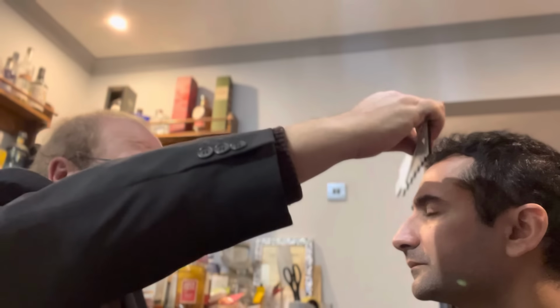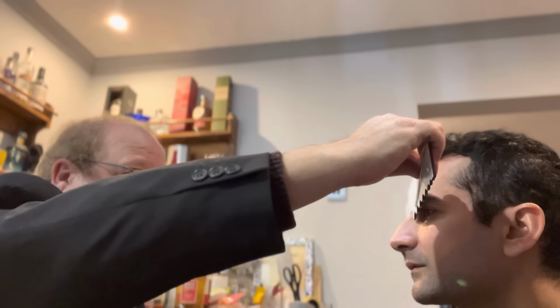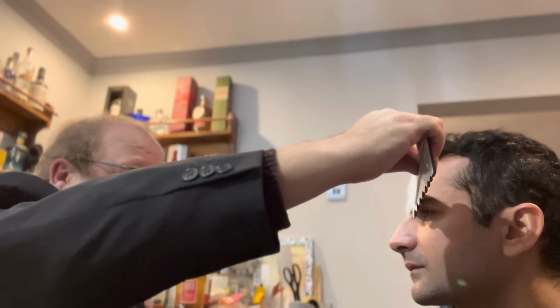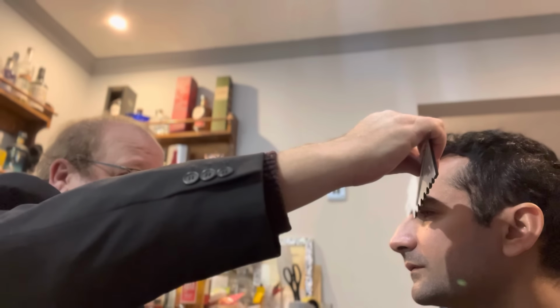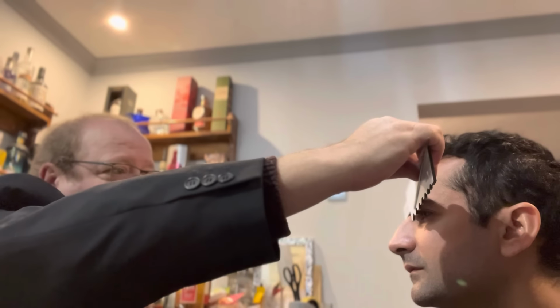The next measurement I want is crest height. With the crest height, you'll see this ruler here. I put this ruler onto the crest of your bridge, and I angle it in about 10 degrees, and this will give me the height to your bottom lid, which is 8. That's your left is 8.